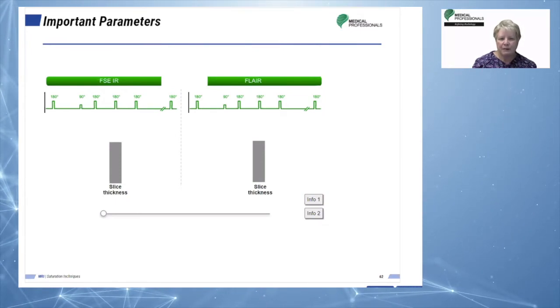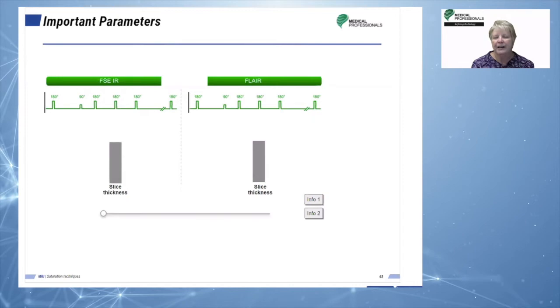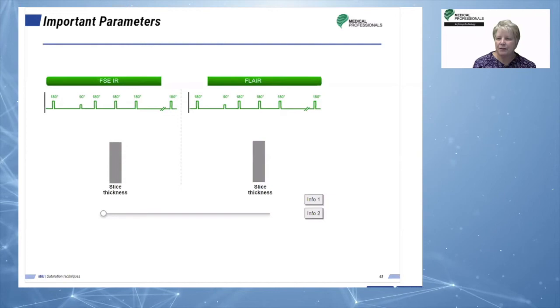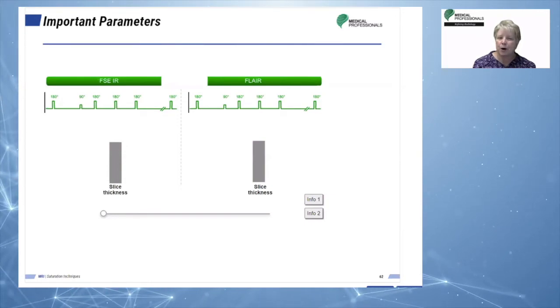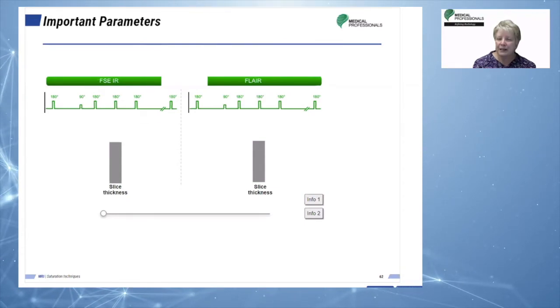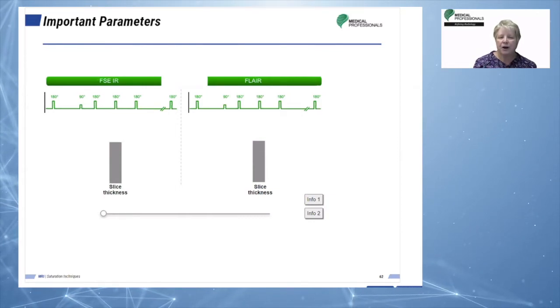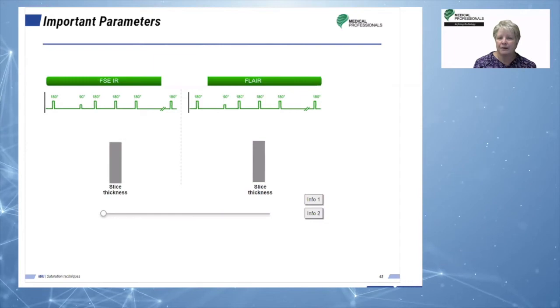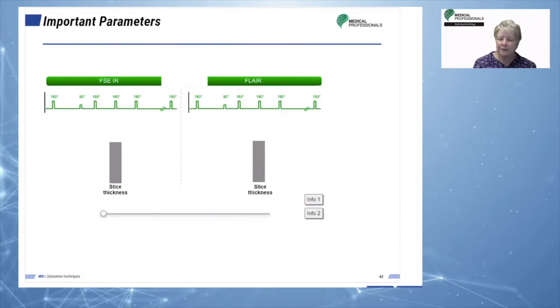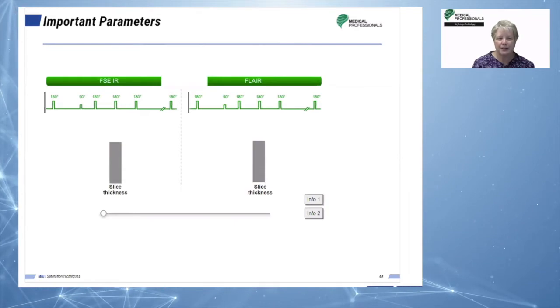There's a simple rule that must be followed. The TR must be 4 times higher than the time of inversion. The time of inversion, or the TI, is set to suppress the water signal, which is between 2,000 and 2,300 milliseconds on a 1.5 Tesla scanner. Although this sequence can also be set to furnish T1 weighting, it is used primarily for T2 settings. So yes, a FLAIR can be used for T1 imaging. It's just more common with T2.